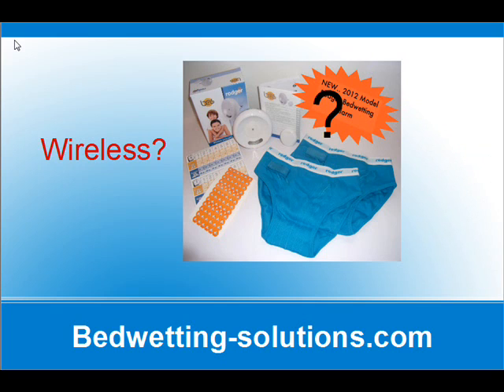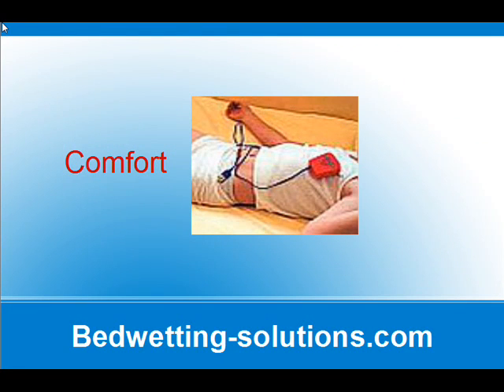Generally, these alarms clip to the shirt, while a sensor picks up moisture in the underwear. So first, you need tight underwear, not boxers or pajamas. Next, you have to choose between sensors and clips. And don't let pictures like this mislead you. The wire really should go inside the shirt, not outside of it.